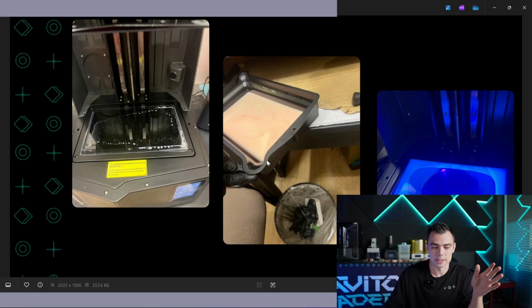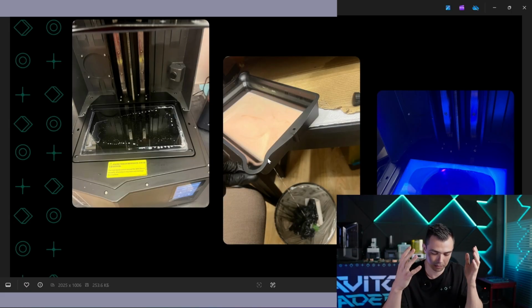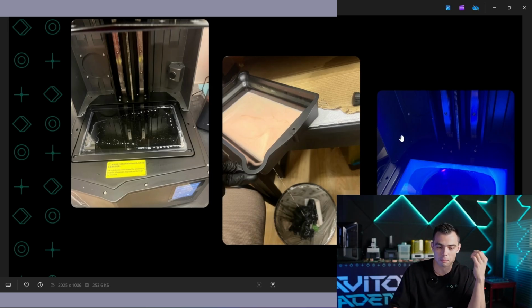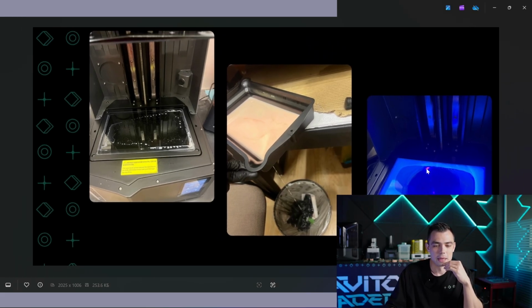So there was a tiny hole, and just before the printing it was not obvious that this hole had been made, and it was made in the evening. Returning back to our lab, we saw no resin in the tank, and the whole amount of resin was inside the 3D printer.